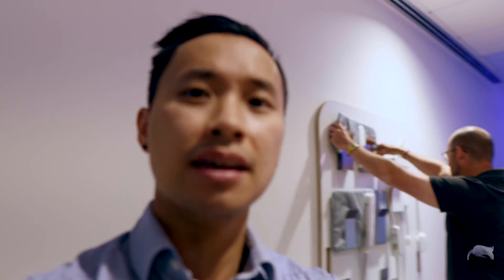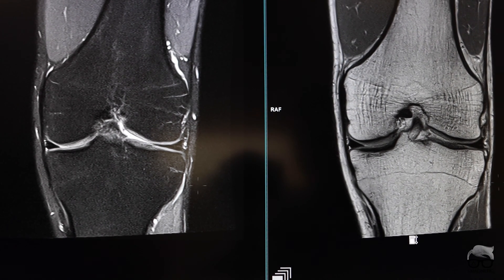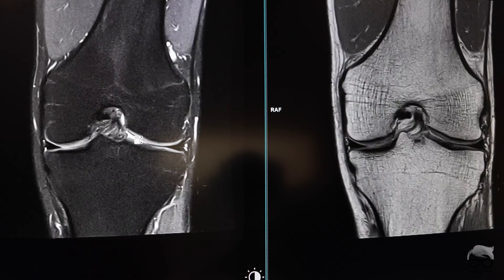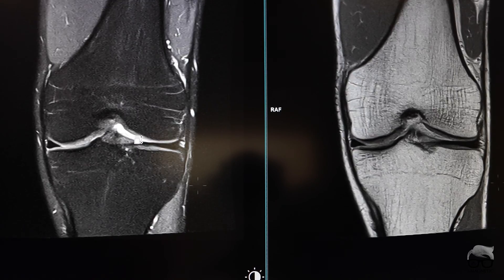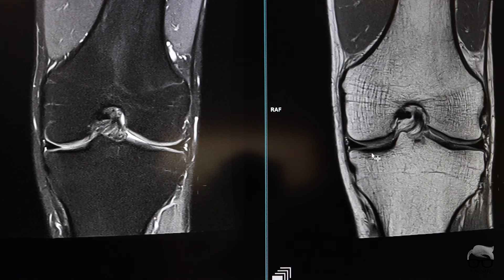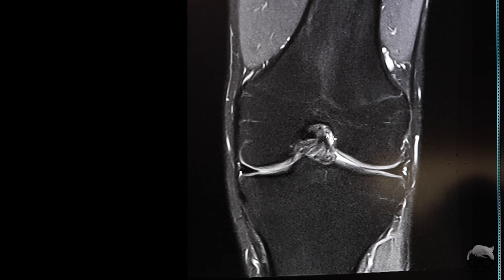There's more future packed in this scanner, but let's show some images. Okay, Benny, are you ready to see some images? Show me what this Max can do. As you can see here, this is a PD FATSAT sequence. It's not that bad for being a 0.55 Tesla scanner, right? It's also a PD without FATSAT. How much time do you think it took to scan that first one? This is a 0.55 Tesla scanner, so I'm going to say six minutes.